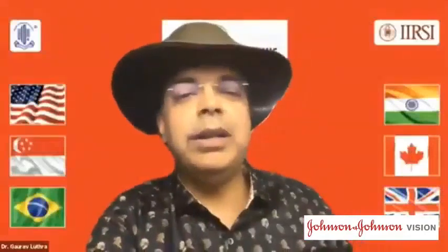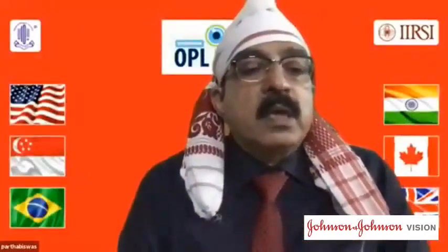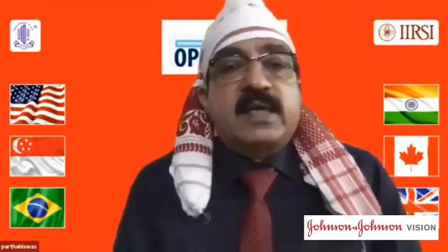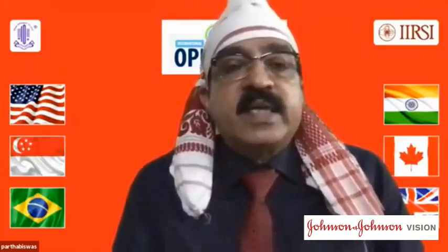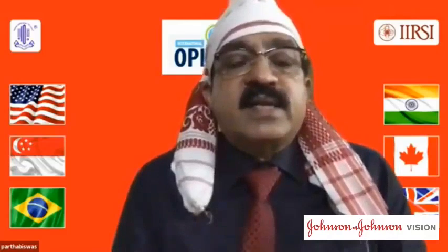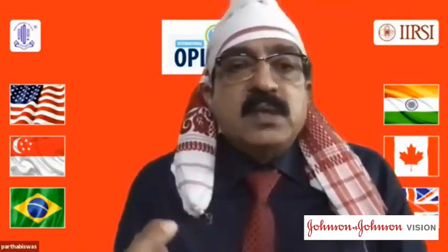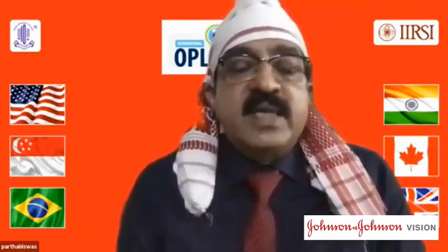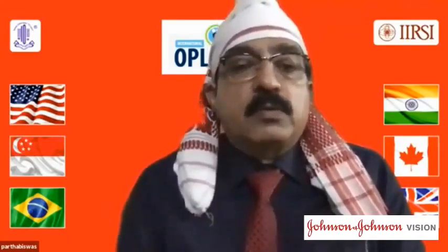Partha, would you like to add any tips over here quickly? Yeah. So yes, cheese wiring is very important, and that actually frays and deters the pupilloplasty that has to be achieved. So I think Mohan said the right thing, that the smaller the holes in the iris created by the needle, the better it is. So that is definitely the way to go.